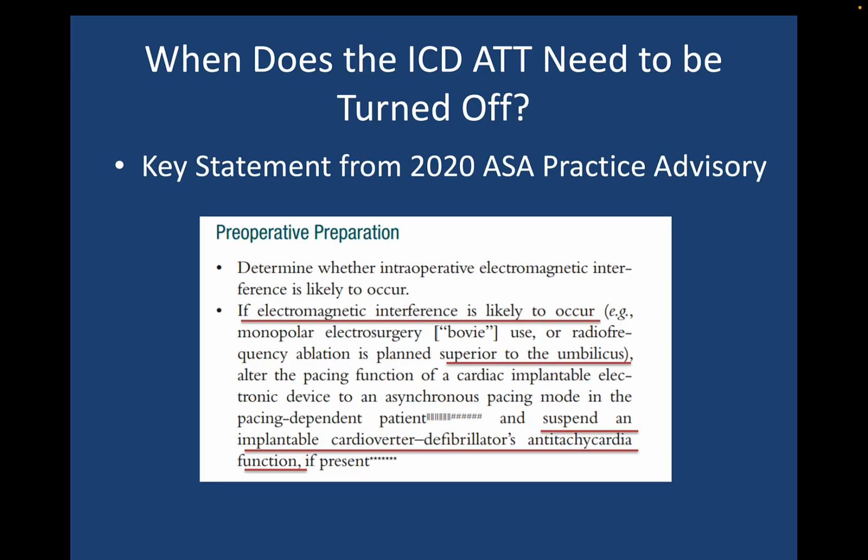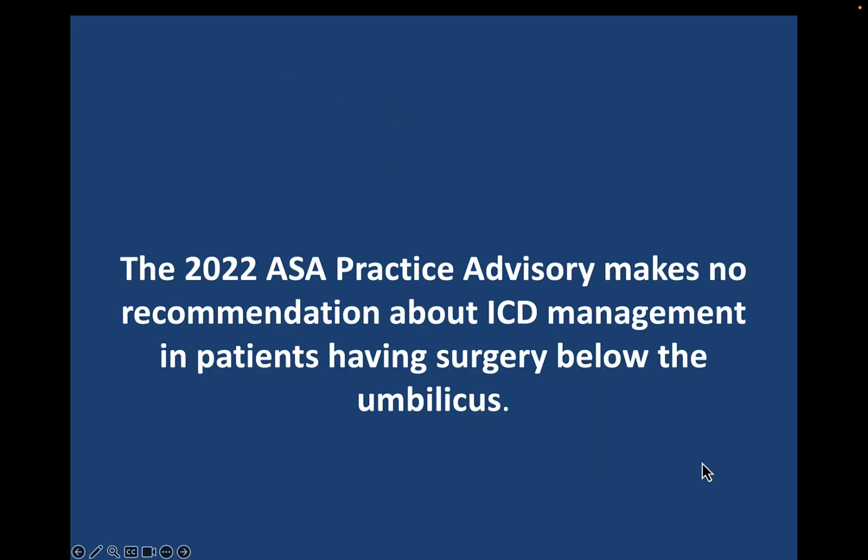And what does the ASA practice advisory say? It says that if electrocautery is going to occur for surgery that's planned above the umbilicus, suspend the ICD's anti-tachytherapy. It does not, and I repeat, does not say anything about what to do when surgery is below the umbilicus.